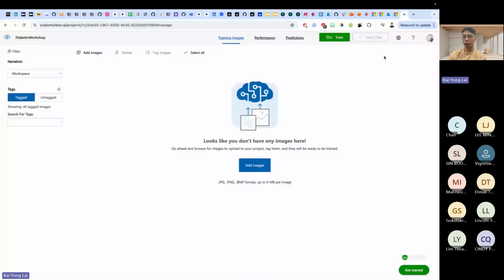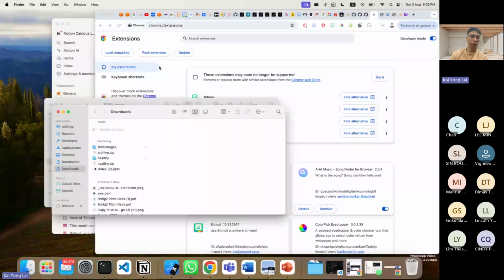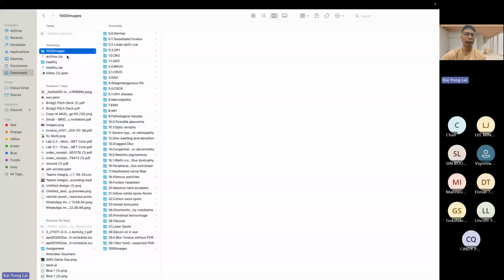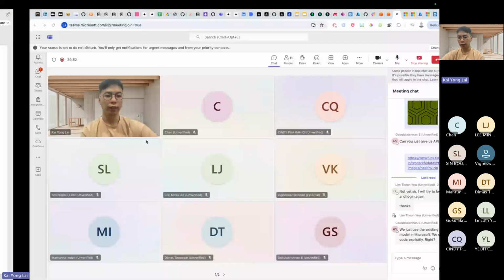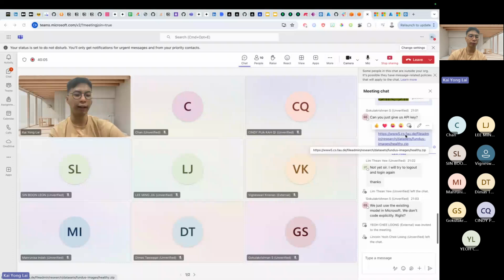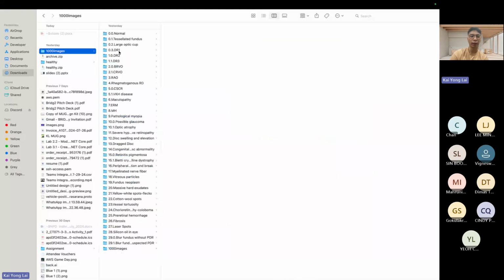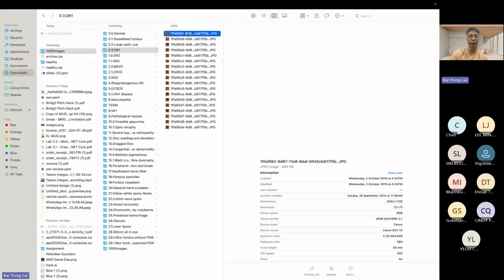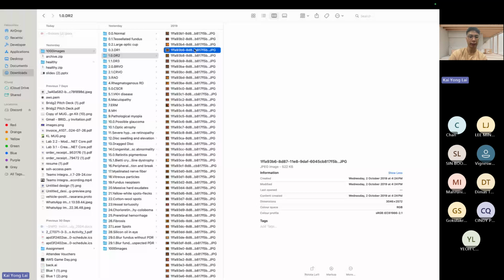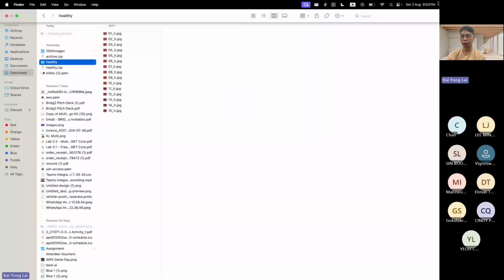Okay, so for others, you can just download the data that is available. But in the meantime, I'll just show you guys how the data looks. All right. So this is the one that comes with the data on Kaggle. And this is the one that comes on the second link, which is the existing model. We don't code. Yes, correct. Okay. The data from FAU, I'm not sure which university, but the data is available here. So these are the normal eyeballs, right? And then in the 1000 images that come from Kaggle itself, these are the eyeballs that have the diabetic disease with DR1, DR2, DR3. Okay, and the normal is the healthy eyeballs. So these are the data that we are going to play with. All right. I give you guys 1 more minute to download the data.